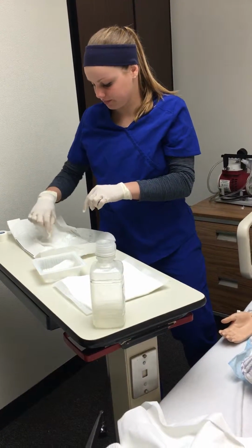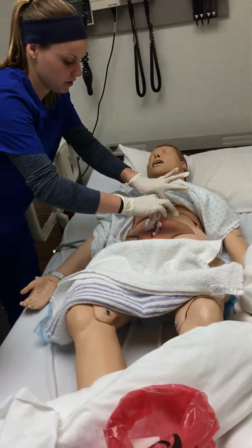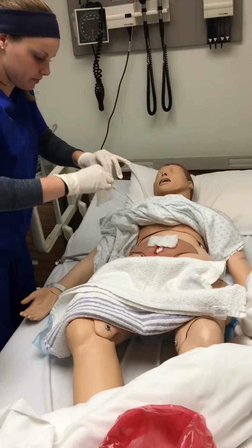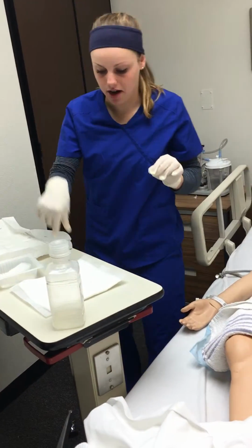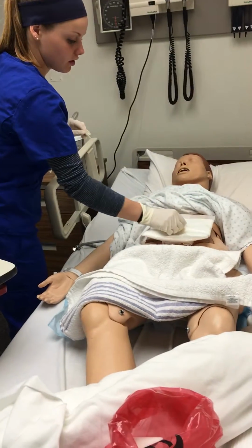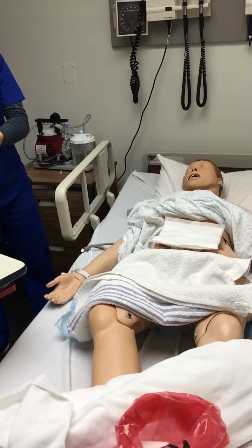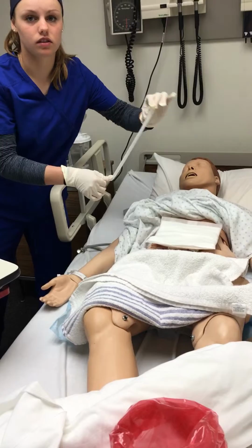Okay. Then we'll use a dry dressing to go over the top of the wound. I can actually use two of them because this is quite a large wound. Then I'm going to take my sterile pad that I had opened up from a sterile package. We'll place it over the top, and then I already have my tape out, so I can just tape that sterile gauze.